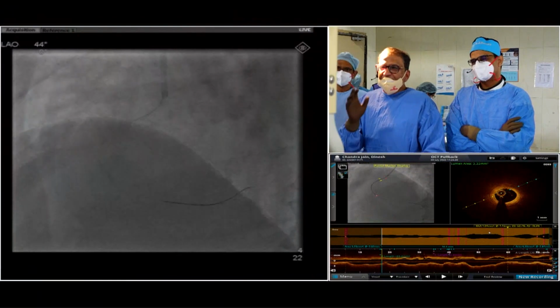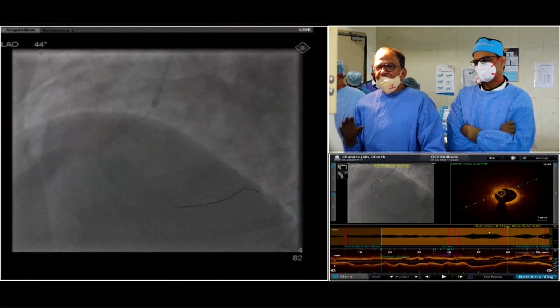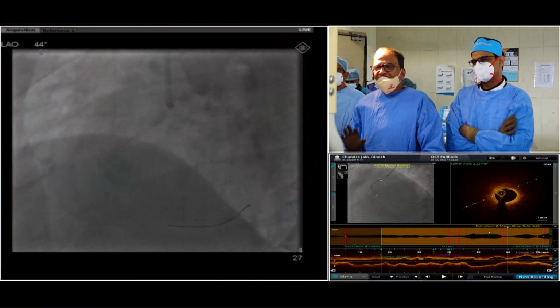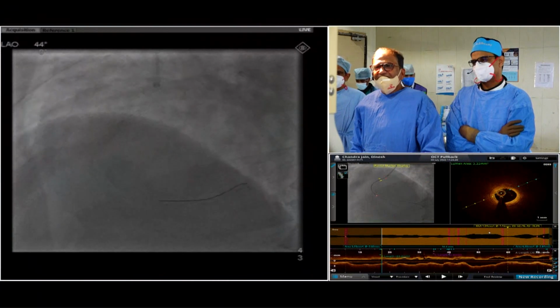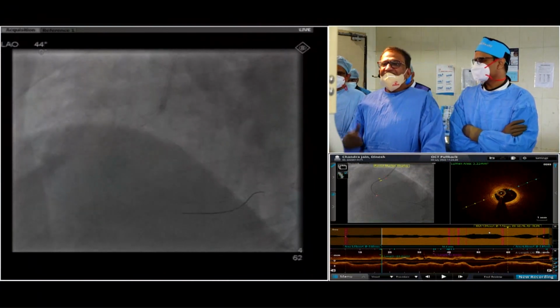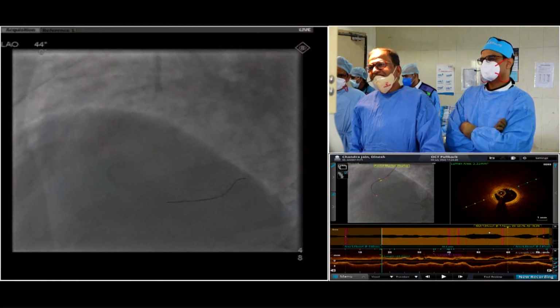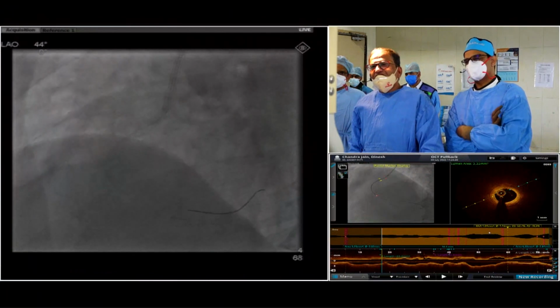I don't know how many people understand. And it really talks to you when you use this wire. So you should know how to use this wire. And in fact, I've changed all my hardware to this baat karne wala wire. We have international faculty who will not understand this Hindi language. But this is a fantastic wire. We crossed it with it.